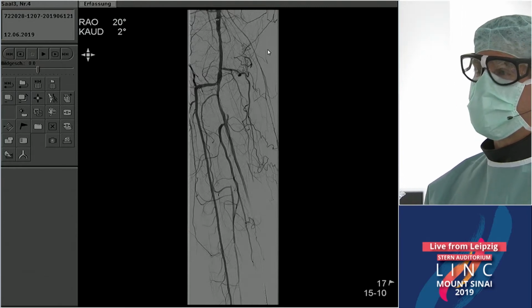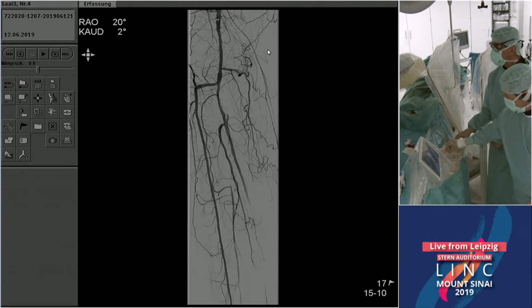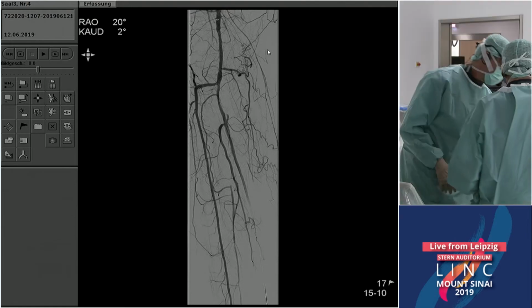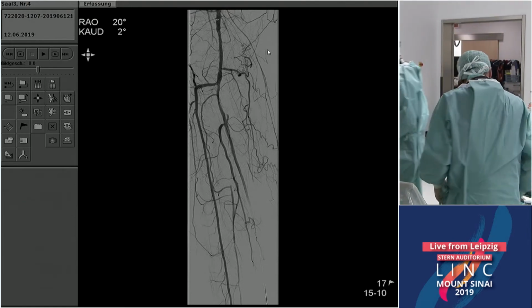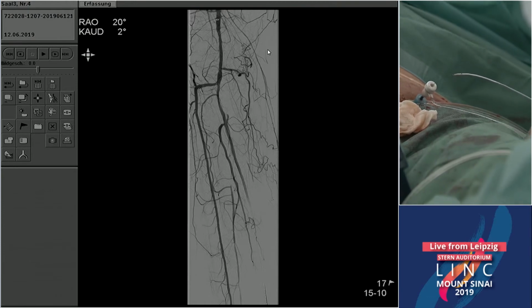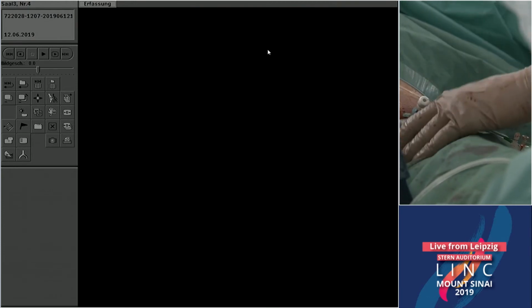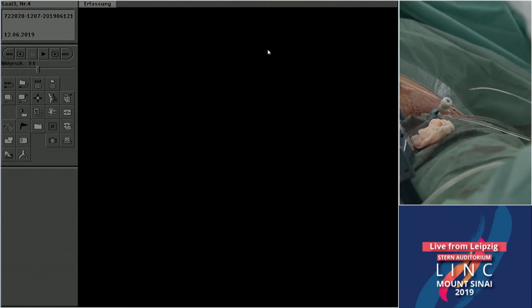But I think I agree with you, Andre. Looking at that angiogram, it's not a dissection proximally that's causing the slow flow. It's a spasm. Agreed. No, but I was looking at the origin of the posterior tibial artery, whether there's a dissection flap there, and whether, if you're dealing with a patient with critical limb ischemia, you'd feel better getting the patient off the table with that tacked up, whether using a tack or a stent, whatever your preference is based on the way that it looks angiographically.